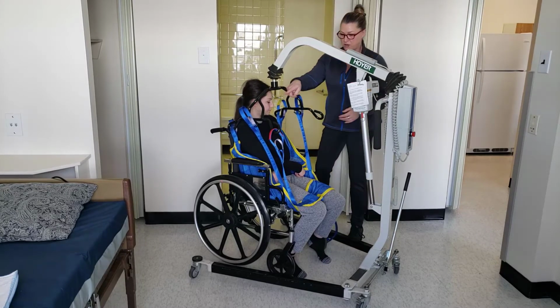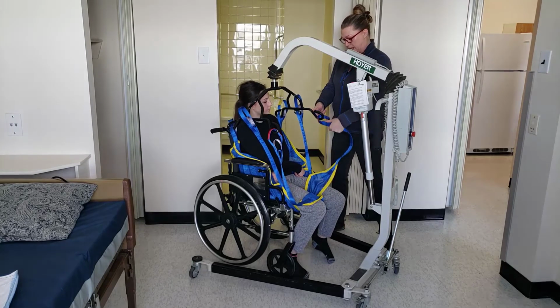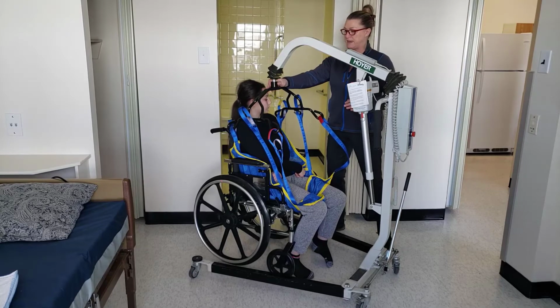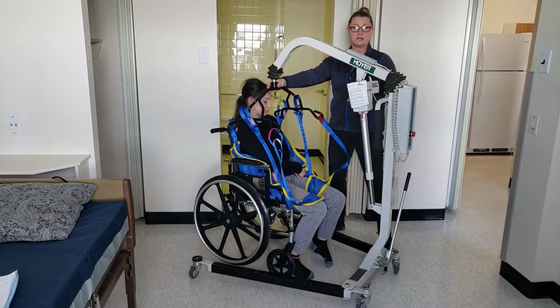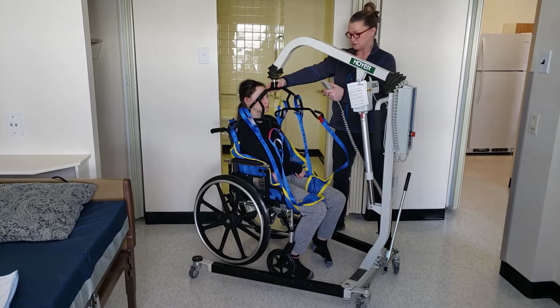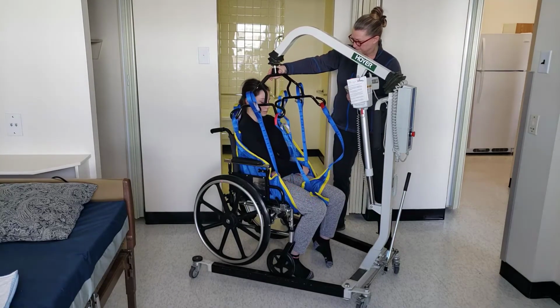And again, making sure all the straps are on the correct loops, and that they're not going to slide off as you're coming up. So I usually put my hand on the swivel bar just so that it's not going to hit them in the head. And as they're coming up, you're just going to watch all the straps to make sure they're not sliding off the loops.